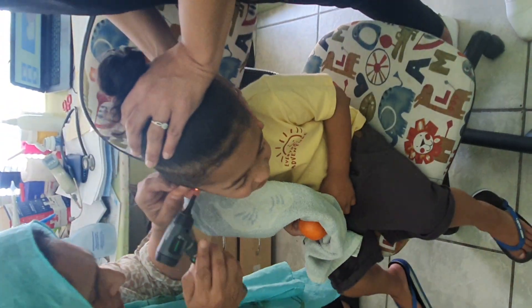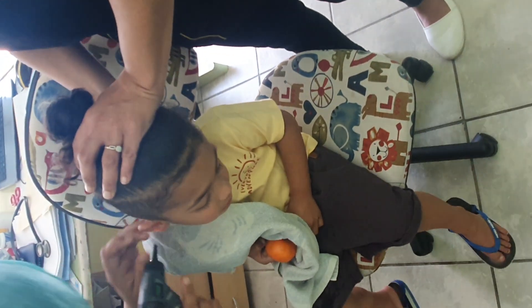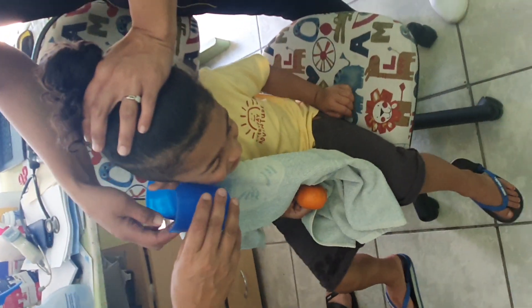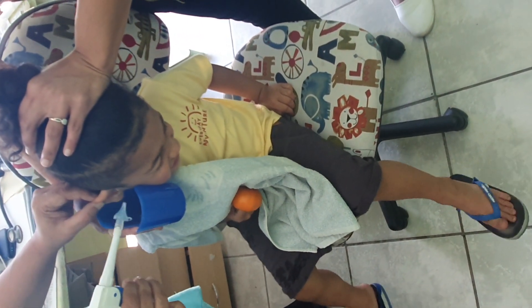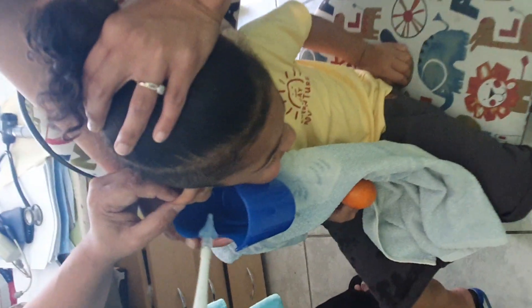You're big now. Just a little bit more in a minute. We'll just put it on that side. You want to come one more time, right? Did it come out?